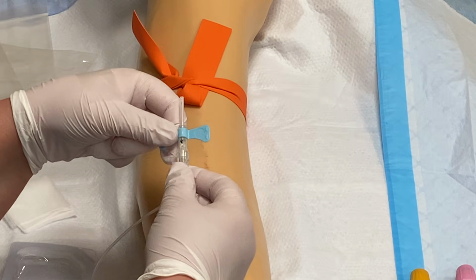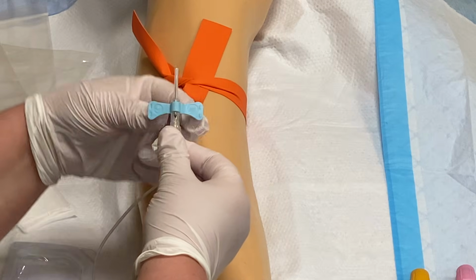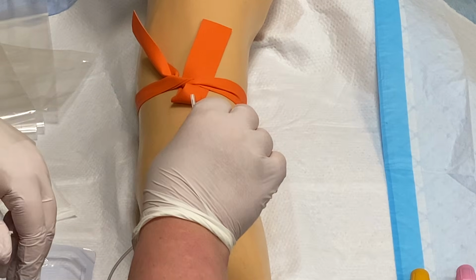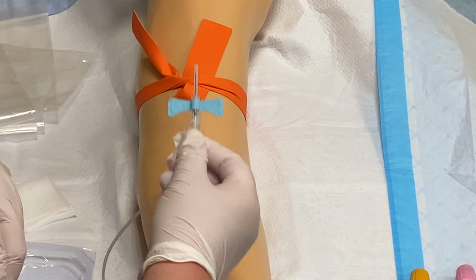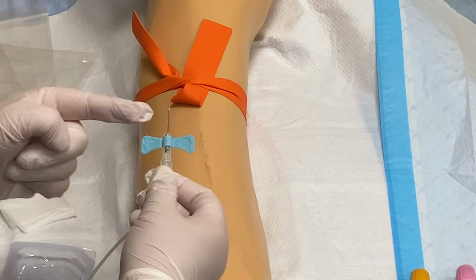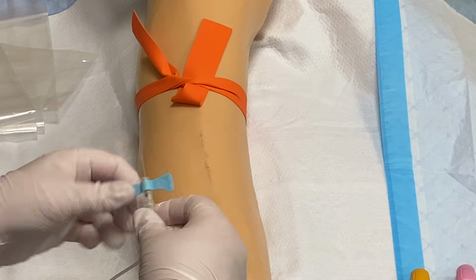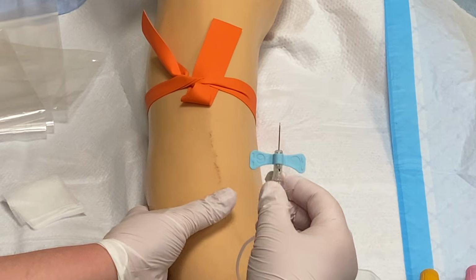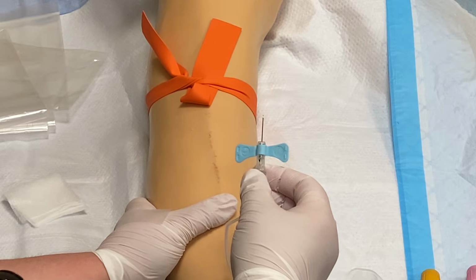For phlebotomy, I can hold this needle 2 ways. I can hold the back of it like this, or I can hold the wings and insert it like that. You can choose whichever method is more comfortable for you. So I'm going to take the cap off my needle. I can see that the bevel is facing me, and I'm gonna get ready to do my insertion by holding or anchoring the vein below the insertion site with my non-dominant hand.